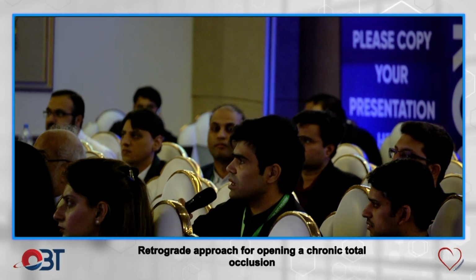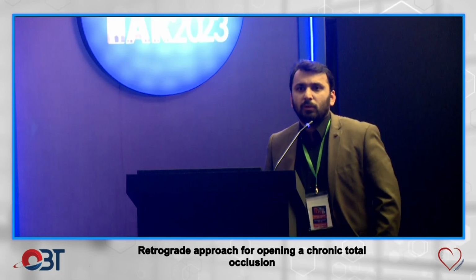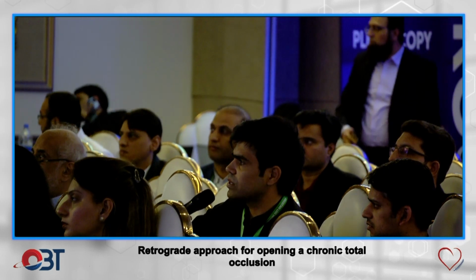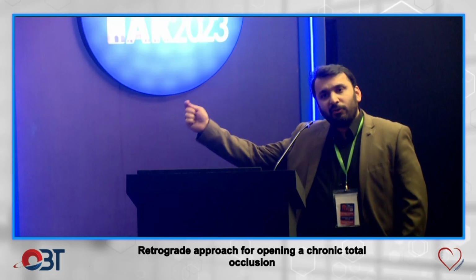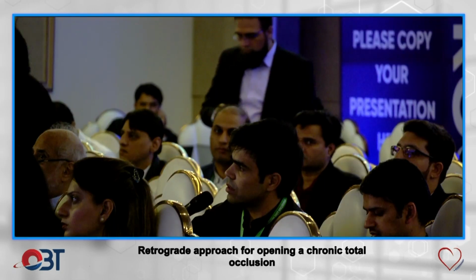Did you use the tip-in technique here? Tip-in, no. Which one then? Rendezvous? Or you just snared it? Probably, no, I missed it. I trapped the wire, and by trapping I pulled up the wire. For support? Yes. For support or just to pull it? Just support.